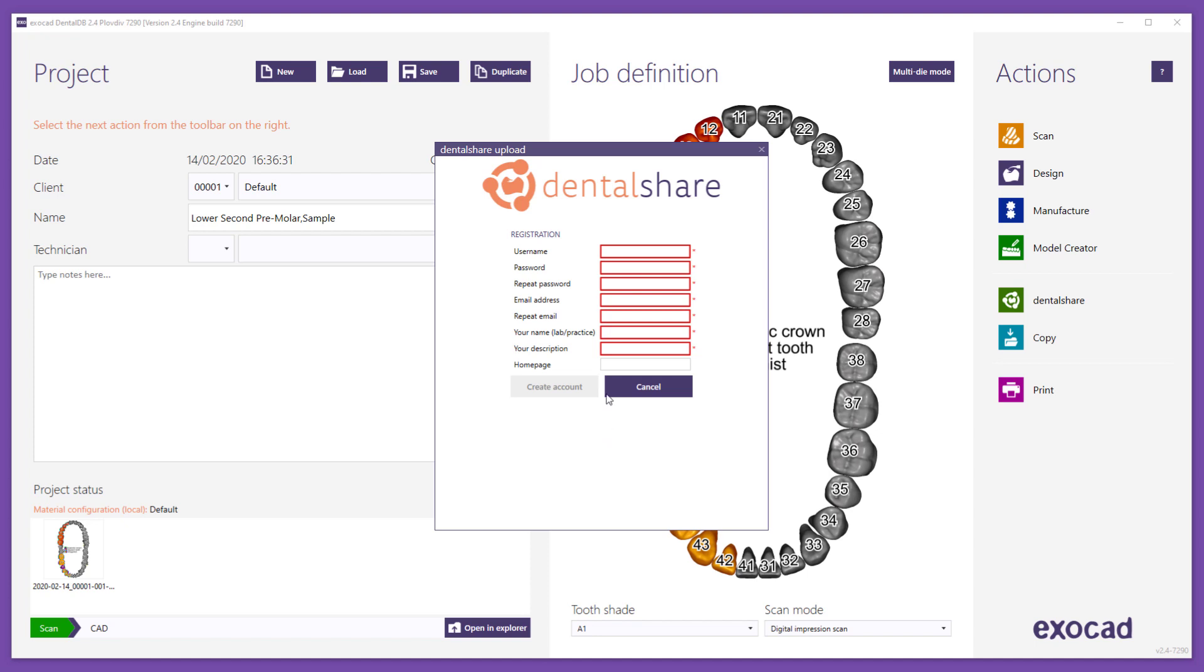Choose a username that does not contain blank spaces or special characters. The password must have at least six characters. Fill in all the other required fields. Click Create account.